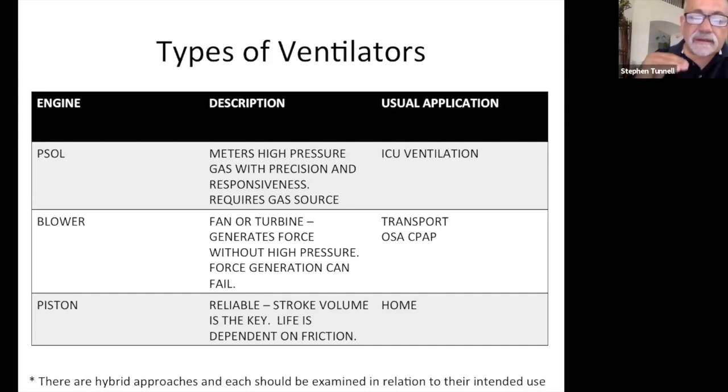And again, the pricing strategy is something we can go over in a later call, but essentially companies give you the platform. It's like an automobile. They'll give you the car, but the features you choose can drive that sticker price up. That's classically the way the ventilator industry operates, and it's very similar to the car industry from that standpoint.